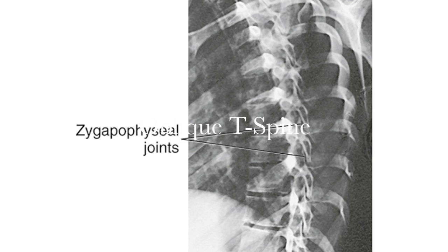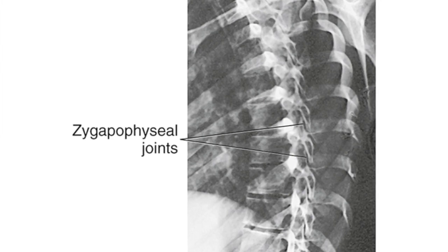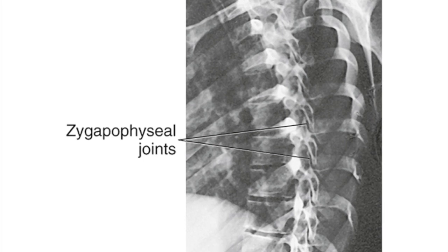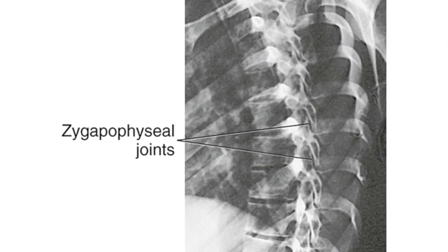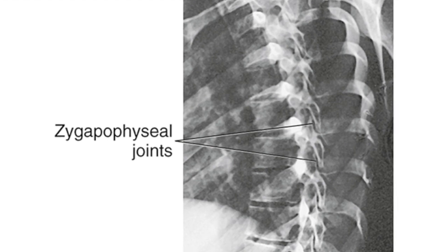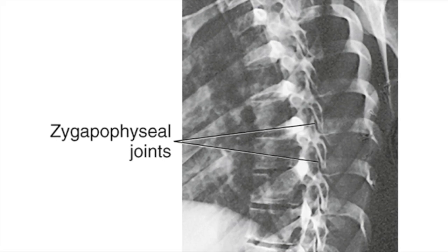This is the RAO position. Some of the clinical indications involve the zygapophyseal joints of the thoracic spine. Both right and left obliques are taken for comparison. The anatomy demonstrated are the zygapophyseal joints. On an RPO position, the joints of the upside are what is demonstrated, and on an anterior position, the joints of the downside are demonstrated. Radiographs may be taken as a posterior or anterior oblique, but anterior is preferred to reduce dose to breast tissue and thyroid.